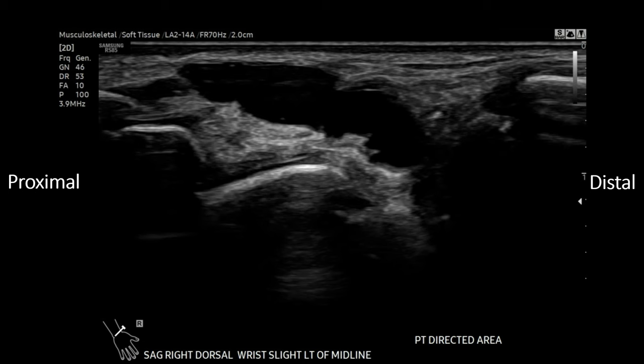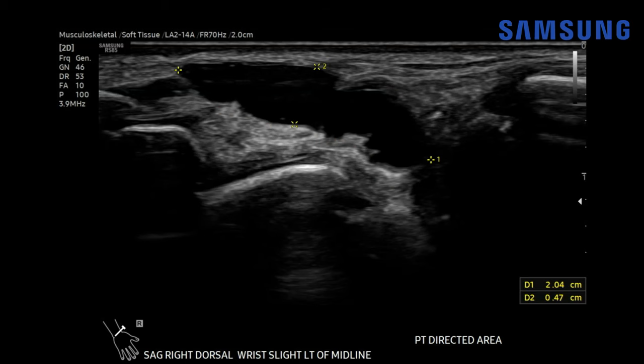Throughout this presentation, just to orient you, if I'm showing a sagittal or long axis image, the left-hand side of the image will be the proximal aspect of the patient and the right-hand side will be the distal aspect. So here we're looking at the dorsal wrist, and there's this lobulated anechoic cystic structure which appears superficial proximally and then dives deep towards the joint as we move distally. It measures about two centimeters.